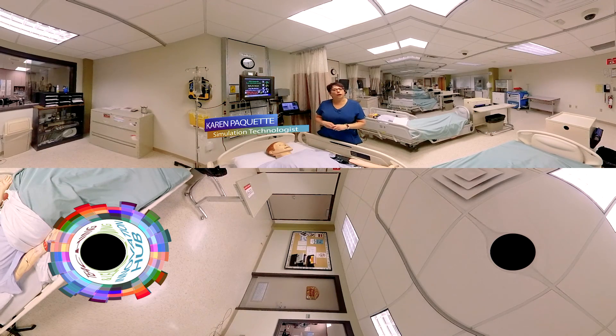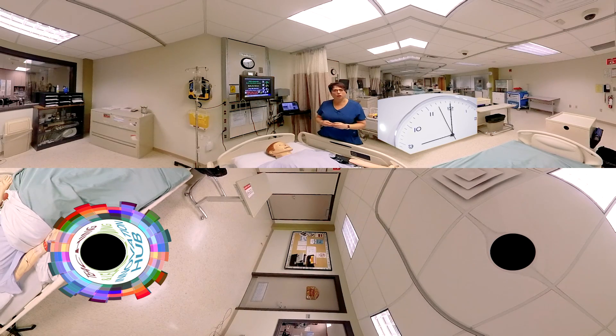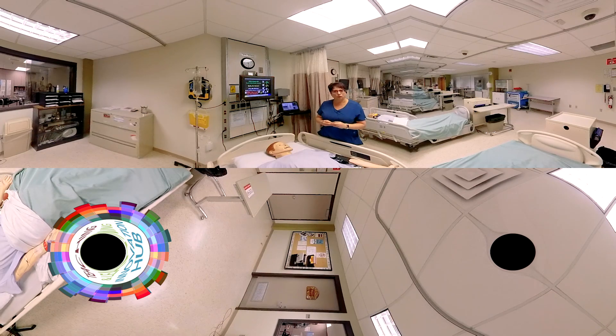First of all, the mannequins are not like a regular blood pressure sound that you're going to hear. You're not going to hear a heart sound, but a ticking sound, like a clock. So you need to listen for that type of sound. And once you hear it, you listen to the first and the last beat and you'll get your blood pressure.